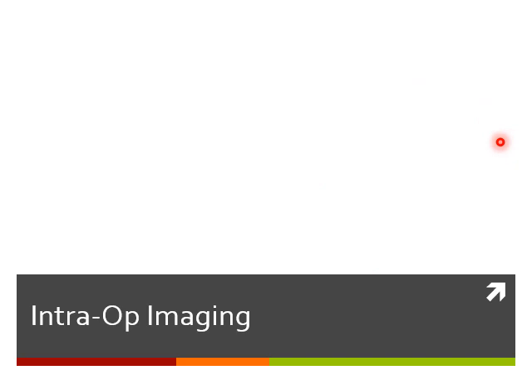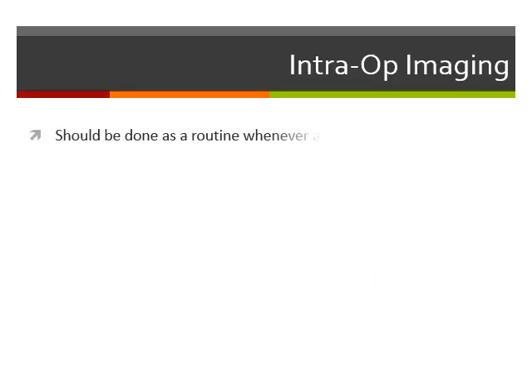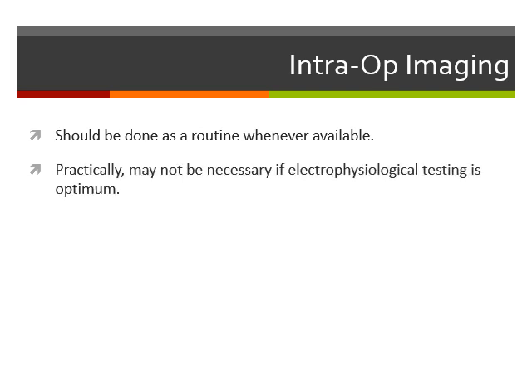Now let's talk about intraoperative imaging. Intraoperative imaging should be done as a routine whenever possible. Practically, it may not be necessary if the electrophysiological testing is optimum, because if it is optimum, I can predict that the electrode is in proper position.